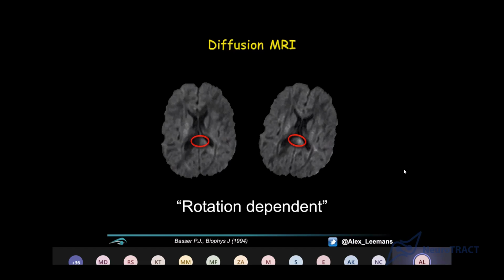And this was a major issue to quantify diffusion. If you have a subject lying, let's call it a patient, in the scanner, and you want to estimate the diffusion coefficient because it says something about the tissue health. Then you do a follow-up, and you want to know, did my therapy work, or did it do anything? You want to quantify this, and you would be computing the diffusion coefficient. But if the subject was slightly different in the scanner, then the diffusion coefficient would also change in that area, because of the orientation dependence.